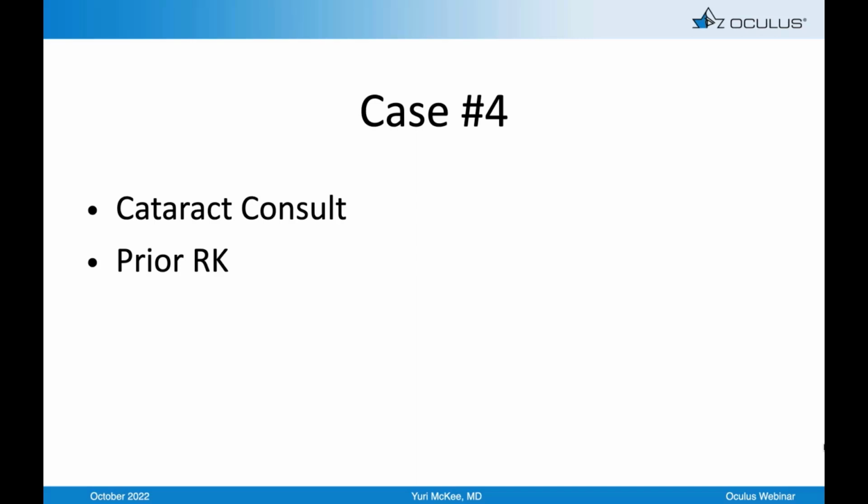So EDOF is a little bit more forgiving, and so you can get away with some borderline cases. The key here is patient education. You promise someone the moon, you don't deliver, you never could have, and they're not happy with you. But show them the tests, involve them in the interpretation of the test. I even do the IOL calculations right in front of the patient. I tell them these are the odds of what we're going to come up with.